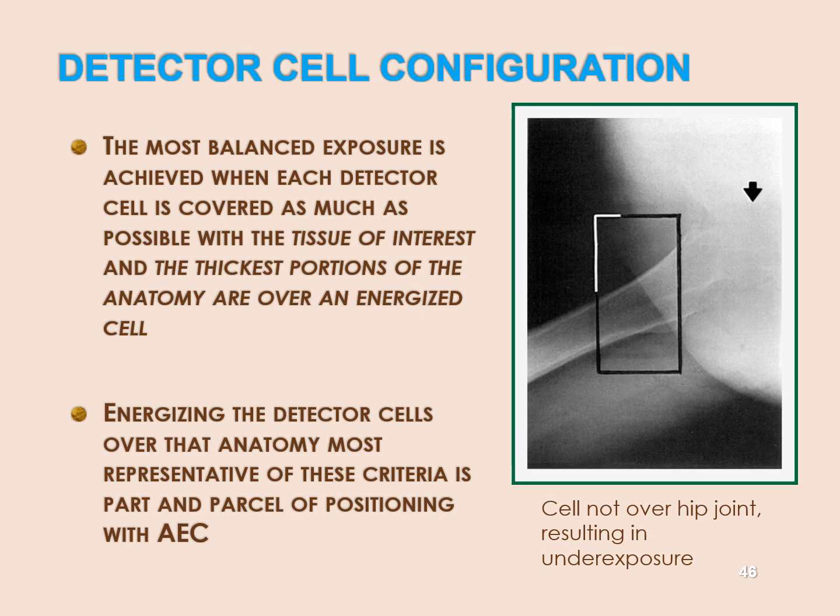See how you can barely see the femoral head and the acetabulum? You can see a little bit of the ischium, right, and the border of the pelvis. But if you centered over where the hip actually was, instead of getting optimal penetration of the shaft, but that's not the area of interest. The area of interest is the hip, the femoral head, and the acetabulum.